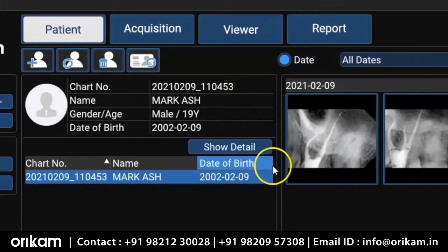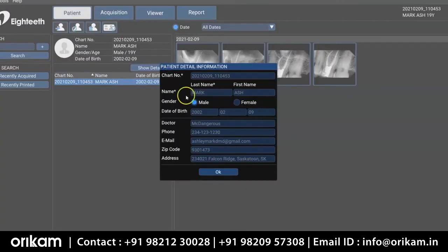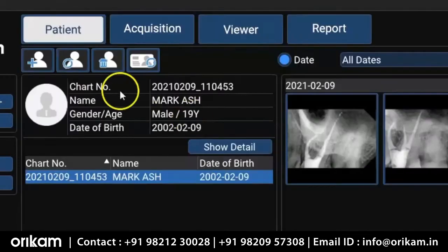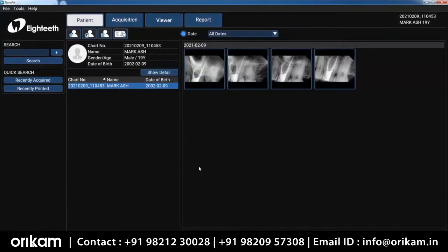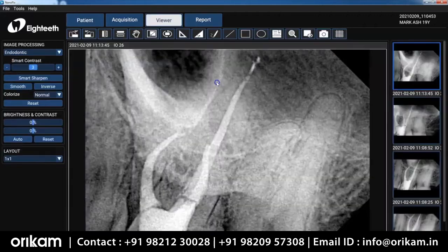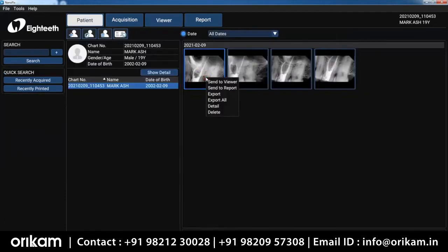There's my chart number. If you want to know some details about the patient, you can just click Show Detail. But if some of those things have changed, like their phone number, you can click Edit Patient and adjust their phone number, their email, and any other things that you need to change. Now, if you double click on the thumbnail in the screen, it's going to open the image into the viewer where you can manipulate the image. If you right click on one of those images, there's a number of tasks that you can complete as well.